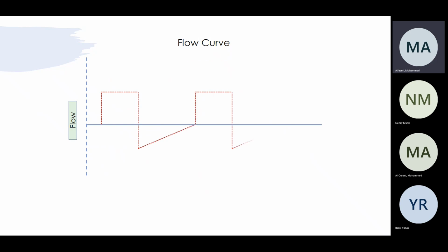All right. Now we talk about the flow. So the distance from here to here, that's the inspiration, is that right? And now we know in volume control, the flow is not variable. It's constant, is that right? So I should not look at the flow to judge what's going on in the lung mechanics.